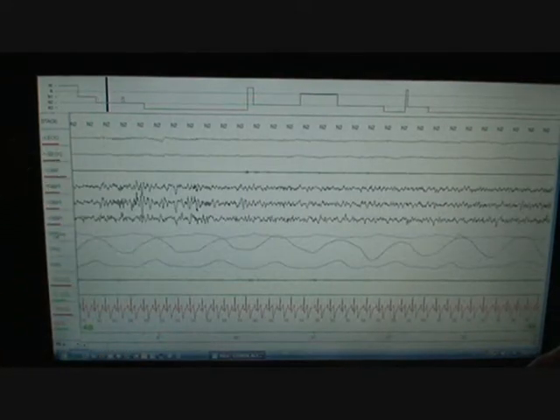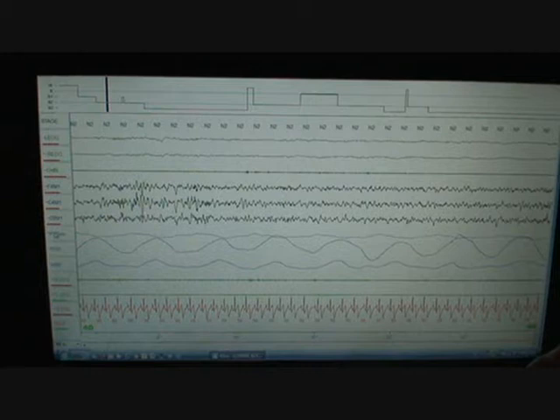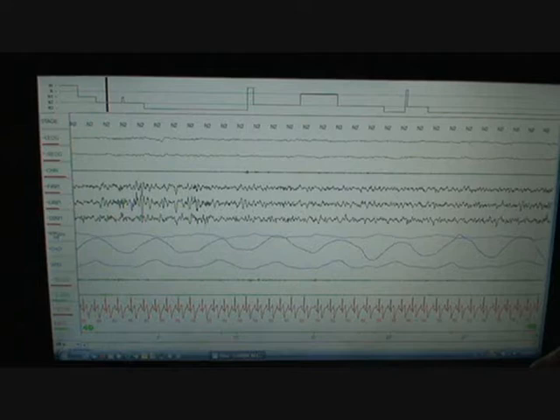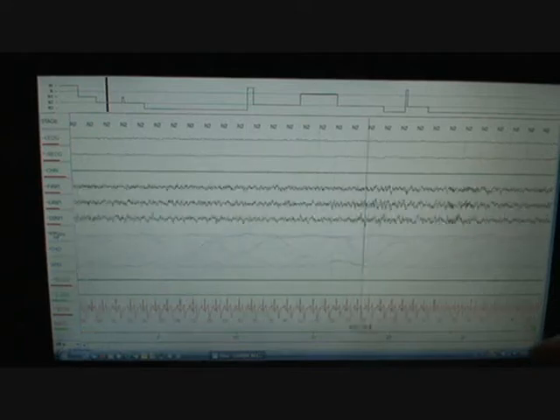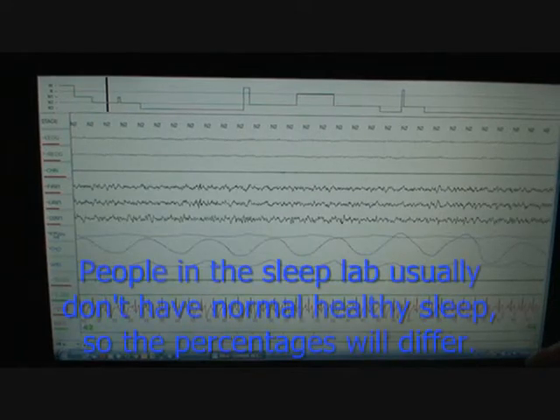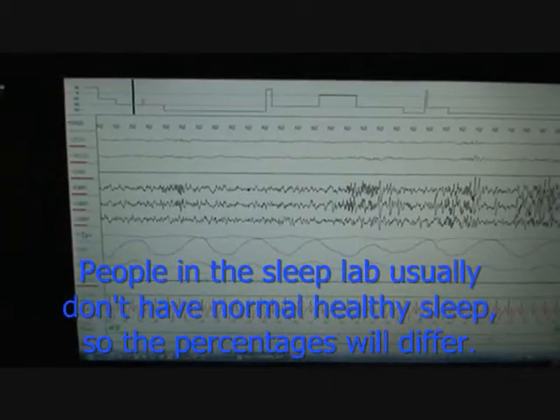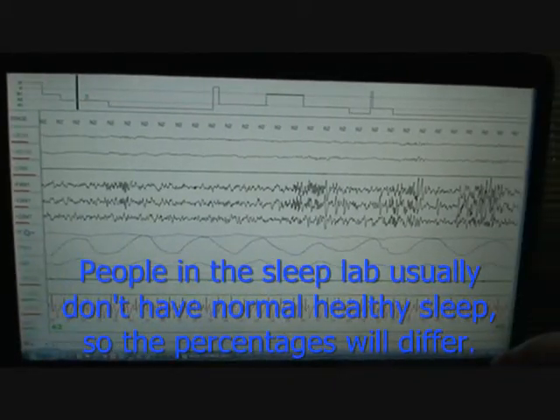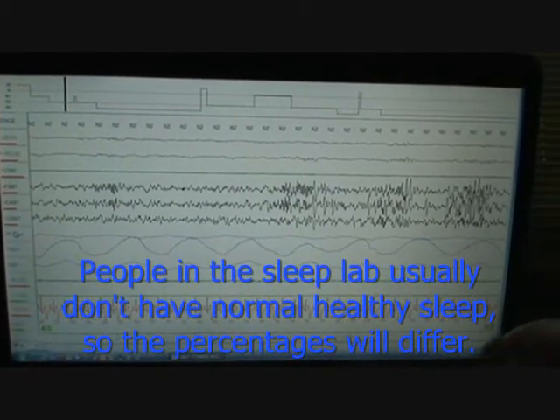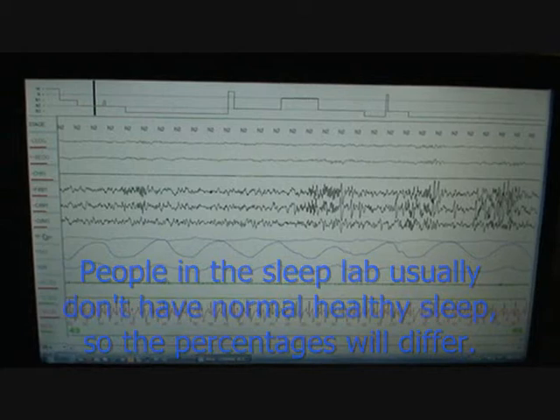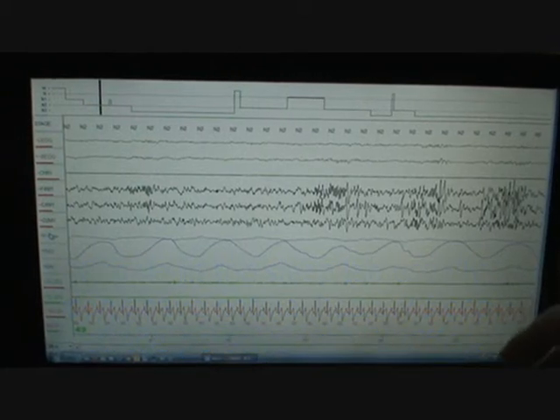You can see stage one, typically in a normal person, it would be five percent of the night. Stage two would be around 50% of the night. Delta would be roughly 25% of the night. And then REM would be another 25% of the night. And these were done with normal, healthy college students by Dr. Rex Chafin and Kales.